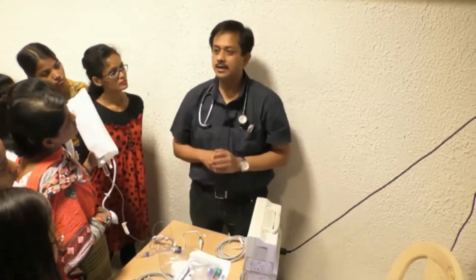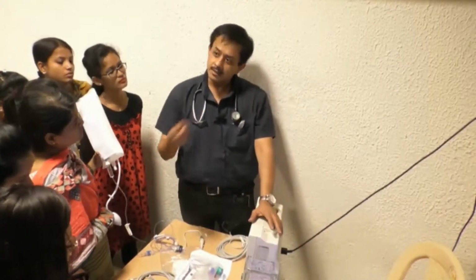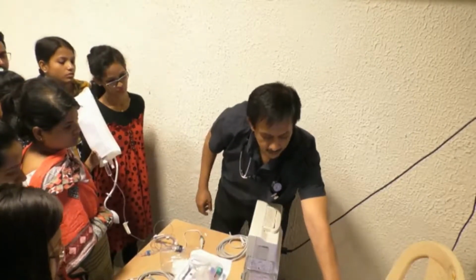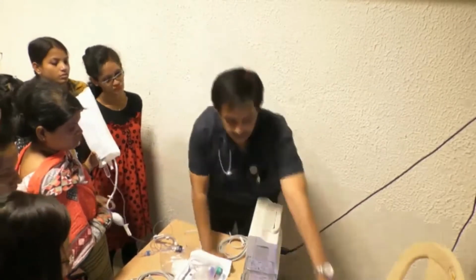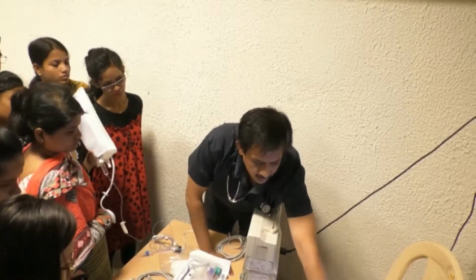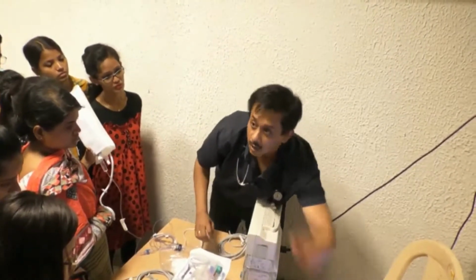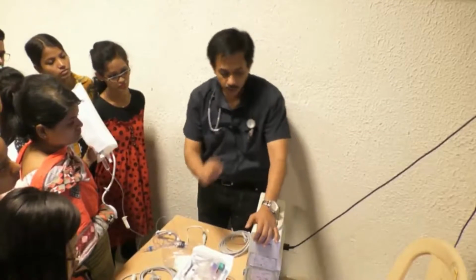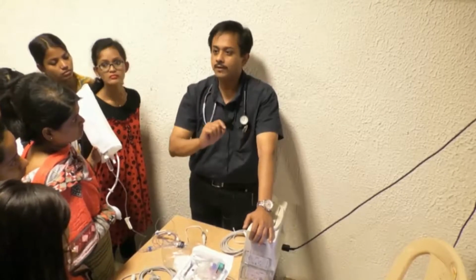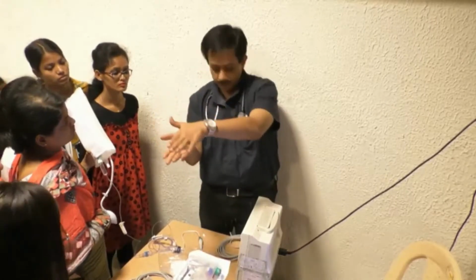There are air bubbles in the system. If there is a kink, or a loose connection. If there are blood clots, or if there is arterial spasm, this can happen. So how do I know, other than the shape of the graph, that it is overdamped? After a flush test, in this case it very quickly, in less than 1.5 oscillations, comes back to the normal baseline. Whereas in a properly damped system, there will be at least 1.5 to 2 oscillations before it comes to the baseline.